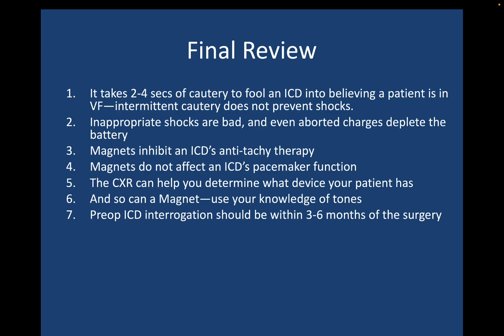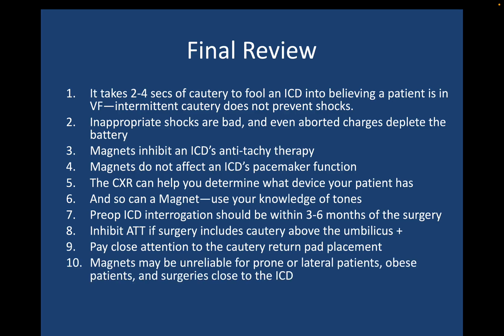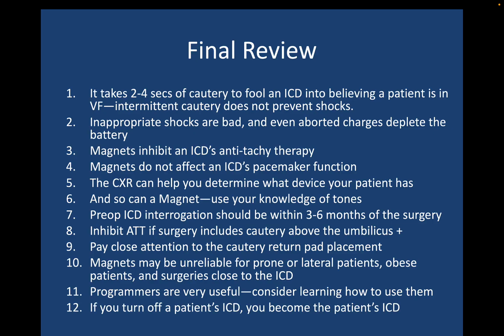Preoperative ICD interrogation should be within 3 to 6 months of the surgery. Inhibit antitachycardia therapy if surgery includes cautery above the umbilicus. Pay close attention to the cautery return pad placement. Magnets may be unreliable for prone or lateral patients, for obese patients, and for surgeries close to the ICD. Programmers are very useful. Consider learning how to use them. And lastly, if you turn off your patient's ICD, you become that patient's ICD.